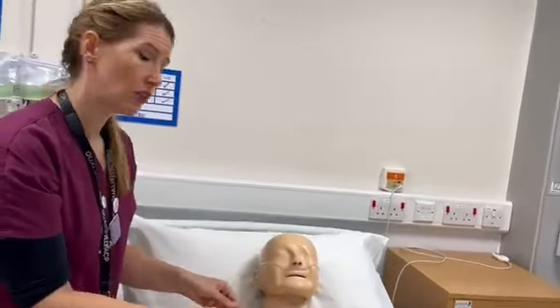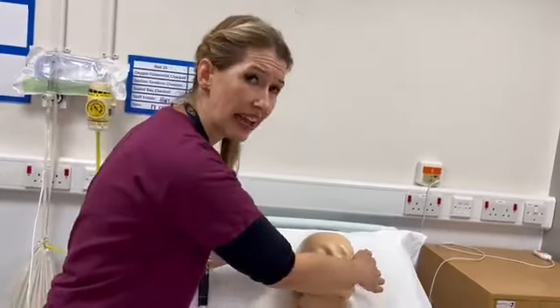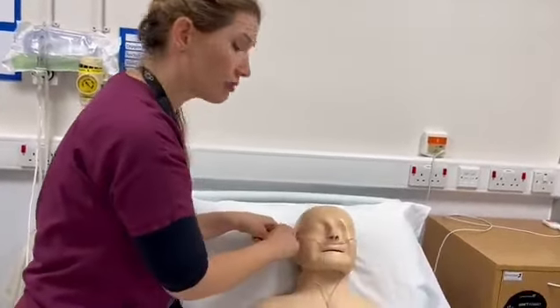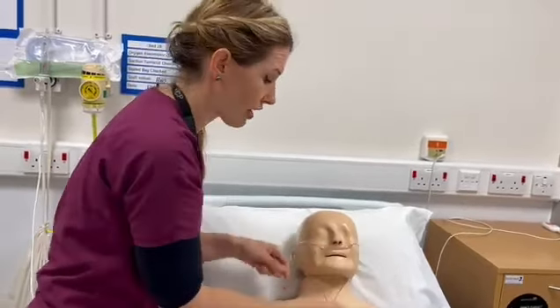Another thing just to be cautious of if a patient is on nasal cannula long term is just to remember they can get little sores behind their ears, so sometimes they need a bit of cushioning, and it's just a site of pressure sore, so do be cautious of that.